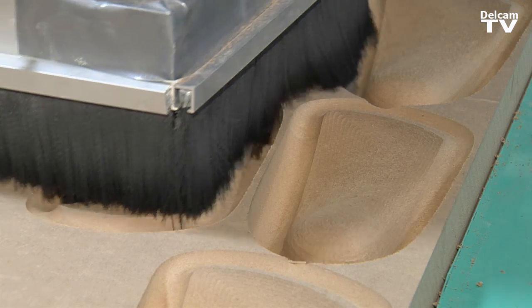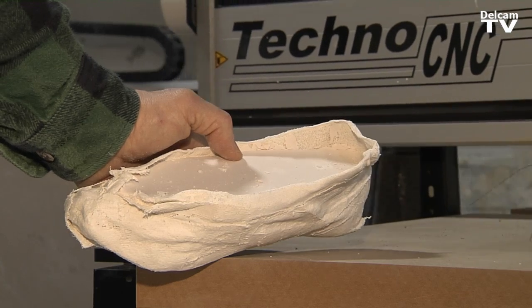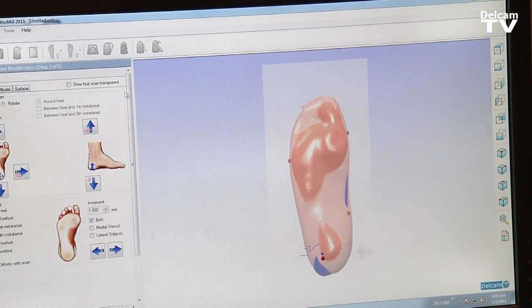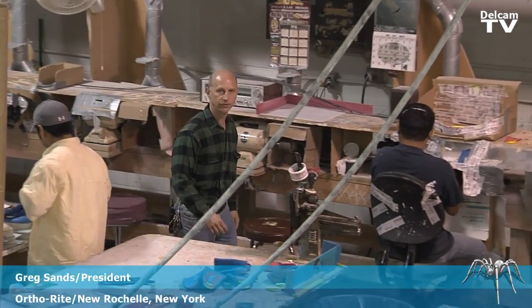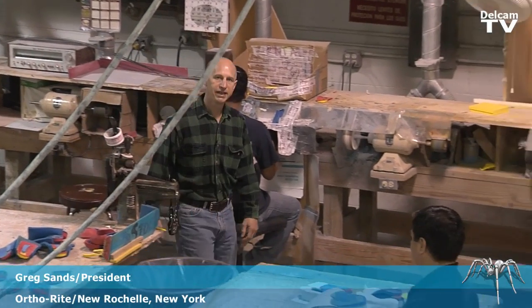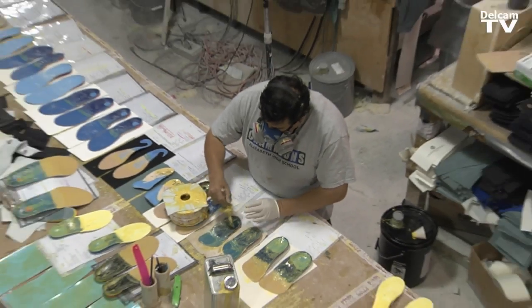DelCam has helped us by creating this — we can eliminate all of this. By creating this, we eliminate that. Hi, my name is Greg Sands. I am president of OrthoRight. Here we are manufacturing foot orthotics by prescriptions from doctors all around the country.